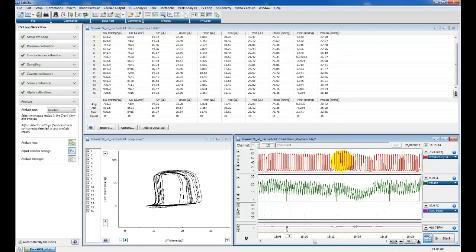but for better analysis, you really want to do an inferior vena cava occlusion or an aortic occlusion. You can do this by pushing on the chest, you can do this by pushing on the abdomen, but for the purest results, the best thing is to do a surgically accessed IVC and then use a little pair of plastic forceps to occlude the IVC for around 3 or 4 seconds.